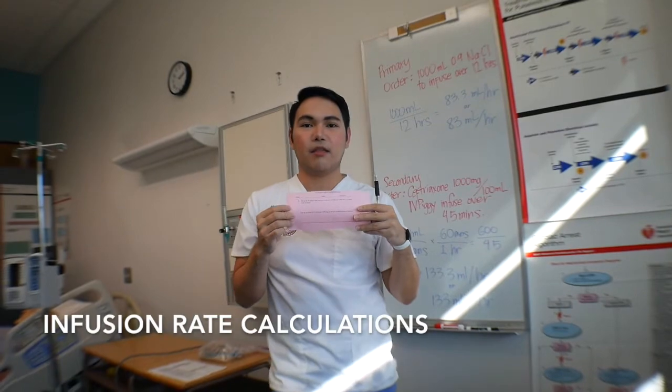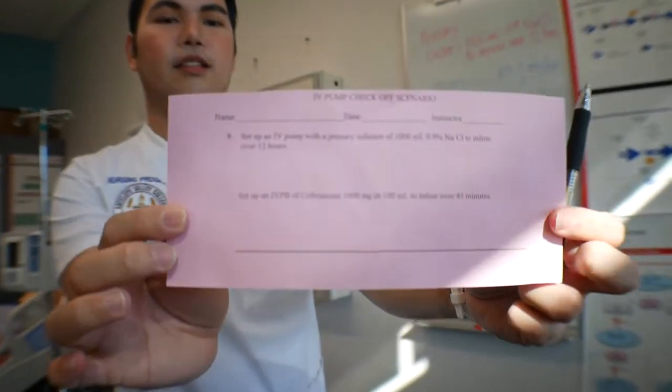After you schedule your check-off, on the check-off day, they will give you a scenario. The scenario could be anything, but it's always going to be a primary and a secondary infusion. Each will have a math problem that you have to solve. So here, this is how it looks.